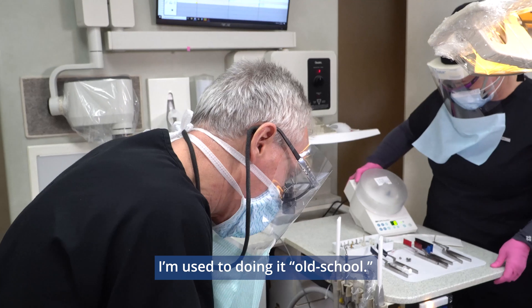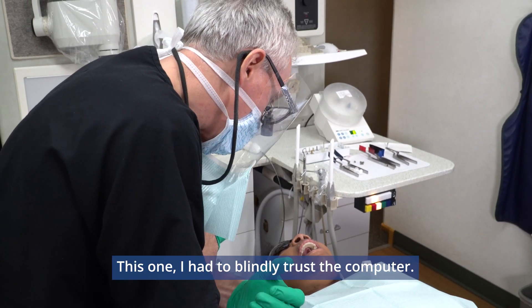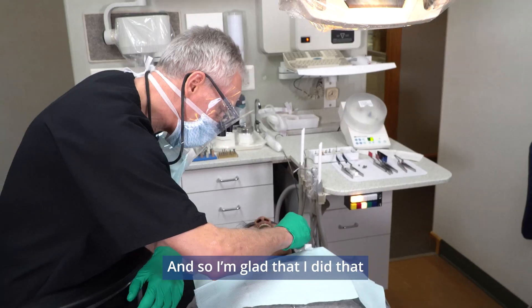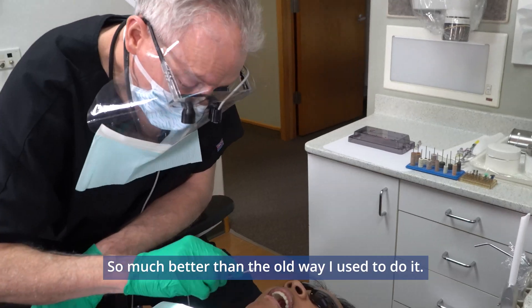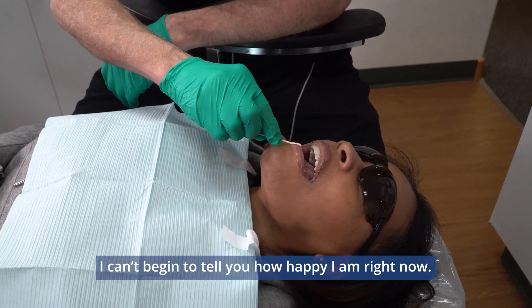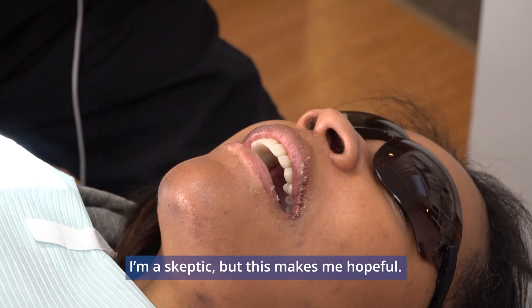I'm used to doing it the old school way. This one, I had to blindly trust the computer, and I was told I should trust it, and I'm glad that I did, because it didn't let me down. So much better than the old way I used to do it. I can't begin to tell you how happy I am right now. I'm a skeptic, but this makes me hopeful.